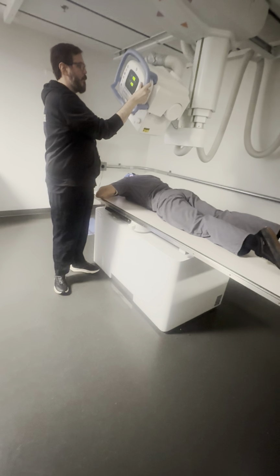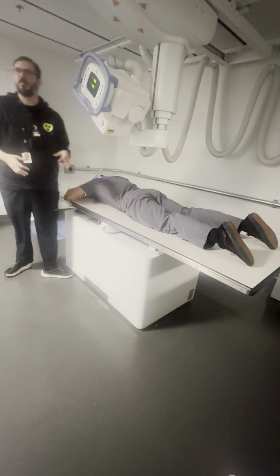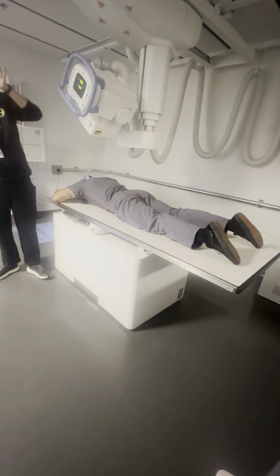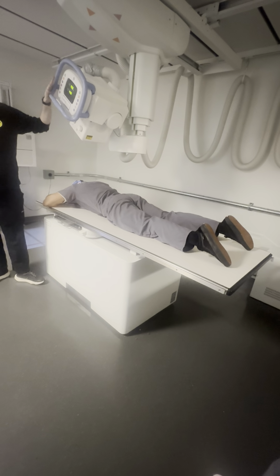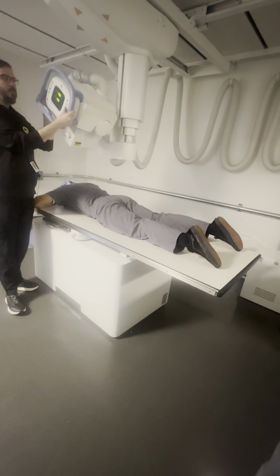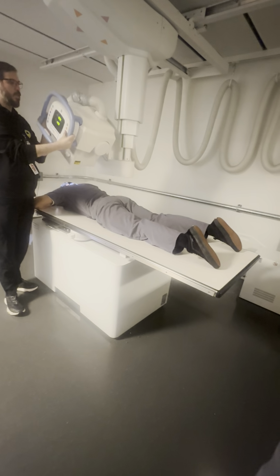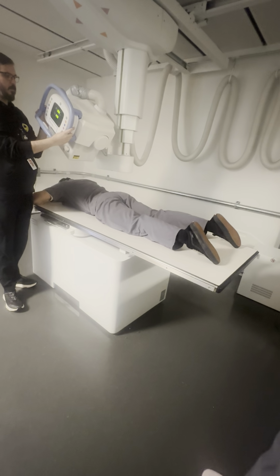No, it'd be 35, 45 for the hypersthenic. Correct. The more hypersthenic, the more everything's pushed up, the greater you have to angle to make up for the pushing, right? So 35 would be for your sthenic patient. So how much do I need to drop? 7 inches. Which would be 30.3. Or 32. You got math like me.